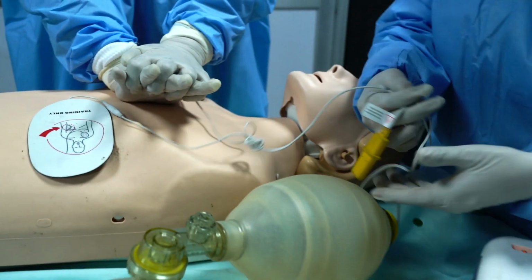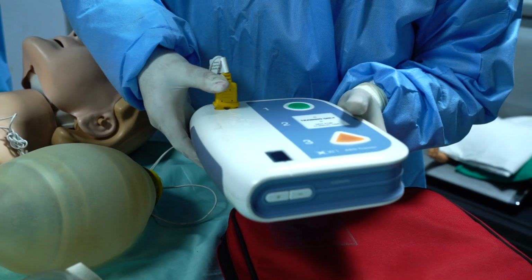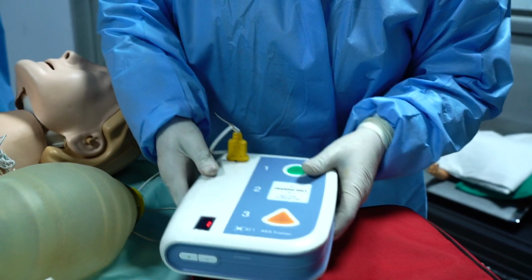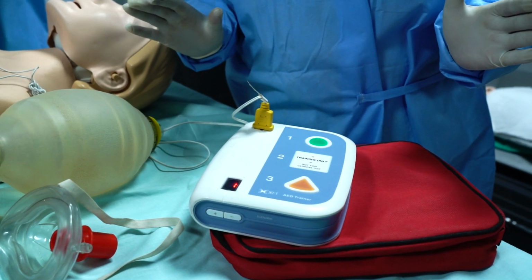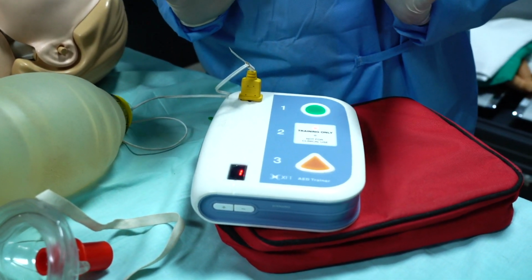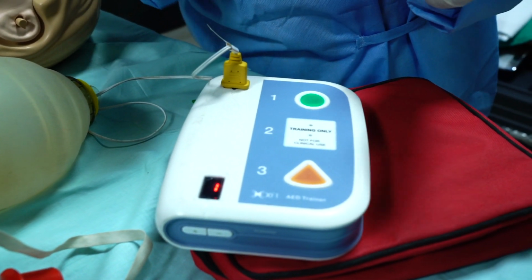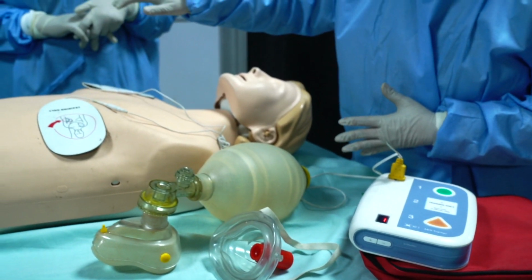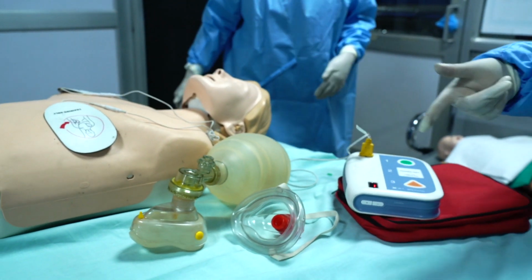Now the third step is to plug in the connection. Now the AED will say, analyzing heart rhythm. The AED will analyze the rhythm. Do not touch the patient. During analysis, we do not have to move the victim. What we have to do is interchange our positions in between. So the person who is performing the chest compression will come to the head end and we will move to the chest compression.